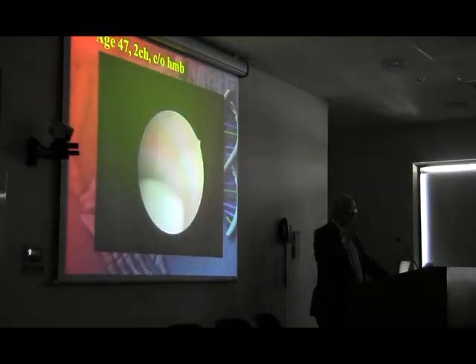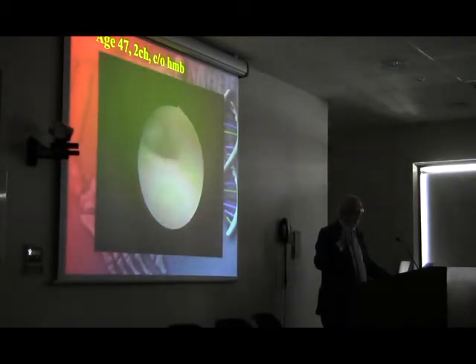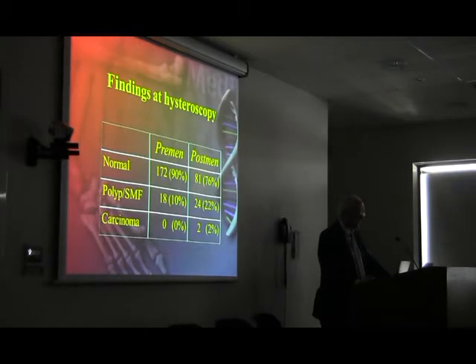So just that little push is needed, but I think it's better just to do it and have the patient aware. If you do it smoothly and quickly, then there's no problem with the patient. Once you get the scope into the uterine cavity, it's much easier and you've got over it. The only difficult bit really is that last little bit, and patients are different. Some patients you can just put it in and they don't even know you've done it, and some will need a little push for that last little bit. But if you tell her there's going to be a little push and just do it quickly, life is much easier for the patient.